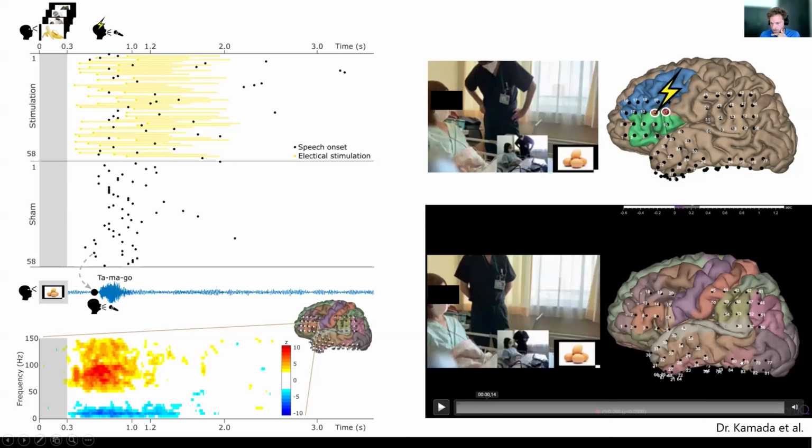They will highlight first, the bubbles appear, because this is the visual cortex. So this is what happens first. There's a visual impression, and then the speech production area gets active here. So I will play it back now. Right. So as I said, first of all, the bubbles appear here, and then the patient was pretty fast. Here, the speech production area gets active.